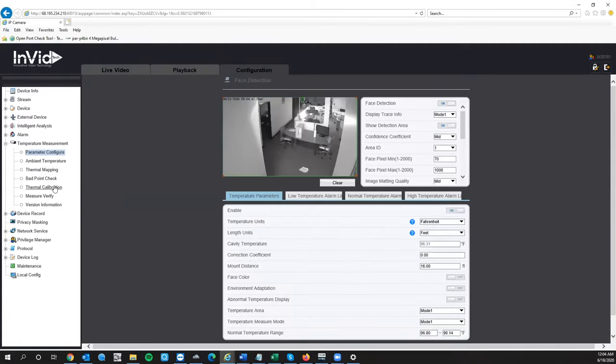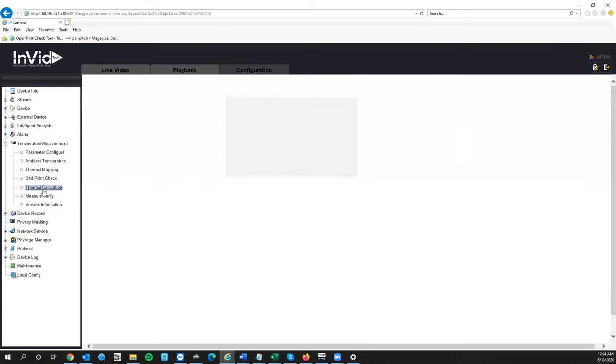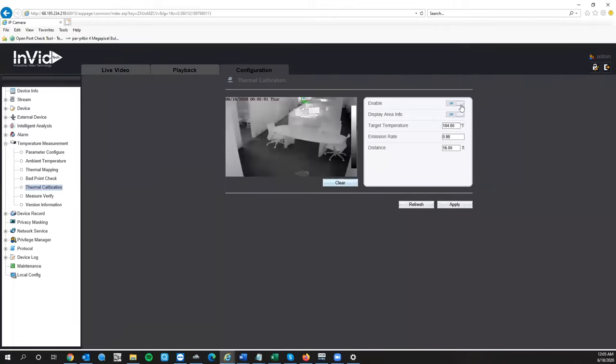The first thing we're going to set up is the thermal calibration. This entire process is getting the camera calibrated properly so you're scanning faces correctly. The calibrator needs to be nine to sixteen feet away from the camera — minimum nine feet, maximum sixteen feet. You'll see the calibrator on screen. First, draw a box around your calibrator by grabbing on the screen with the mouse. You want a very small box right over the face plate of the calibrator. Your calibrator must be visible by the thermal lens.